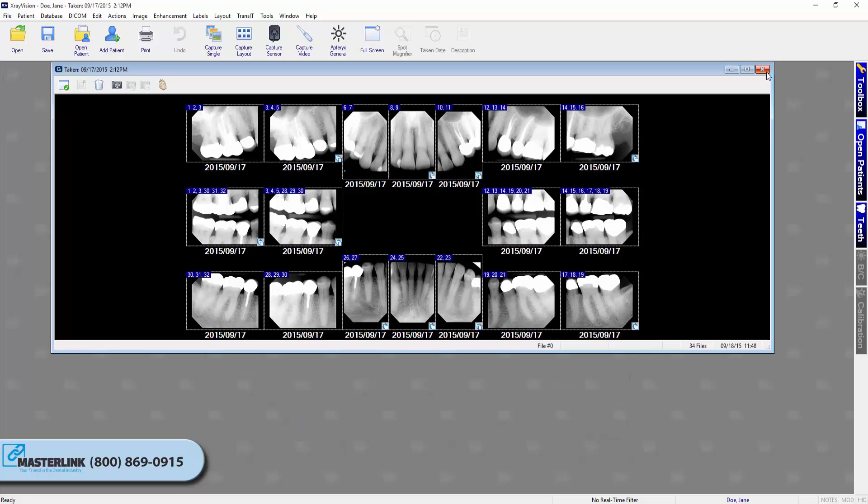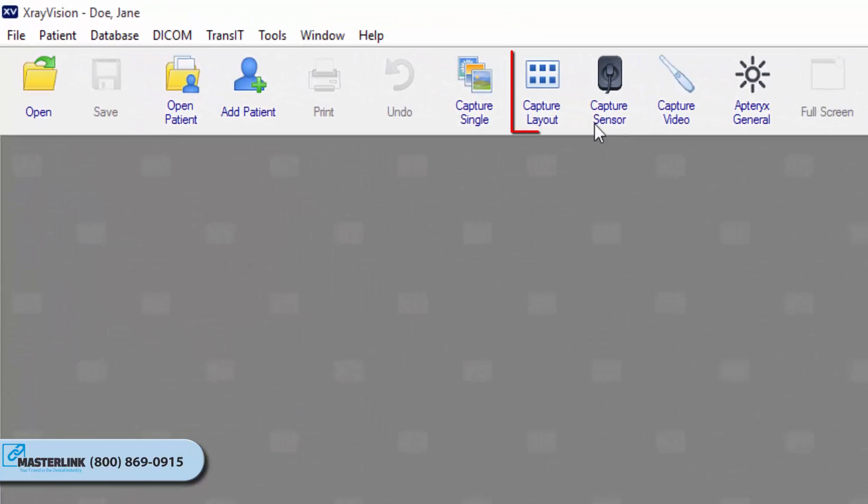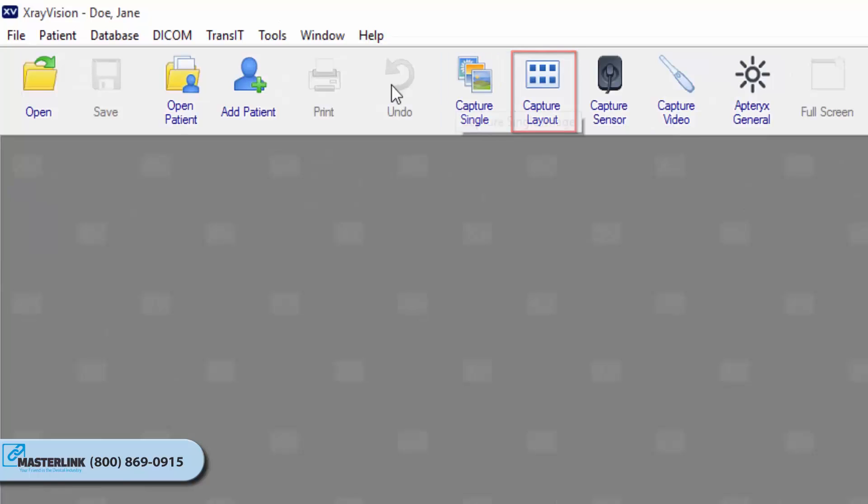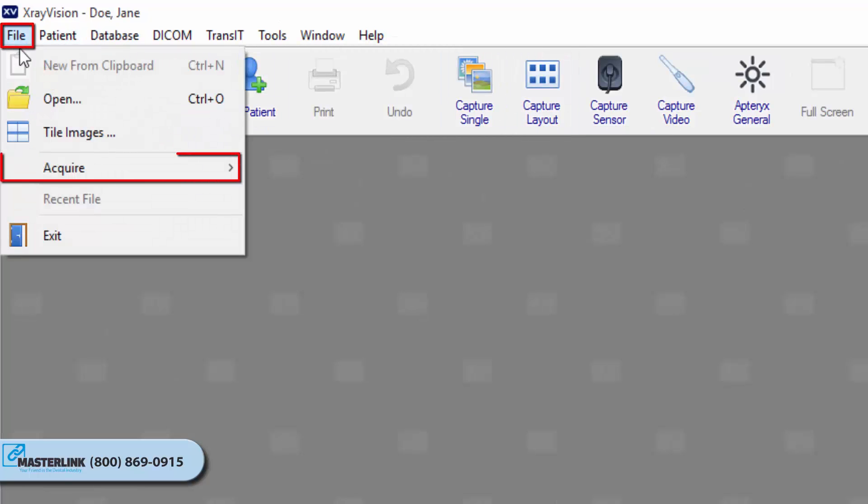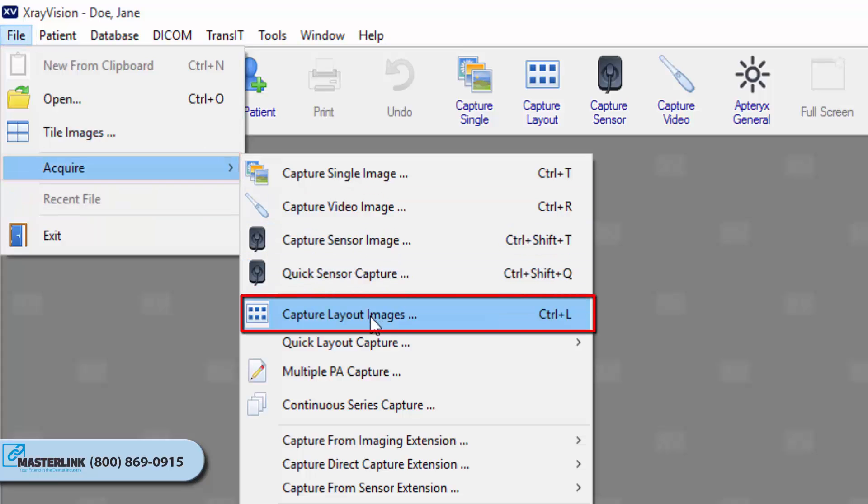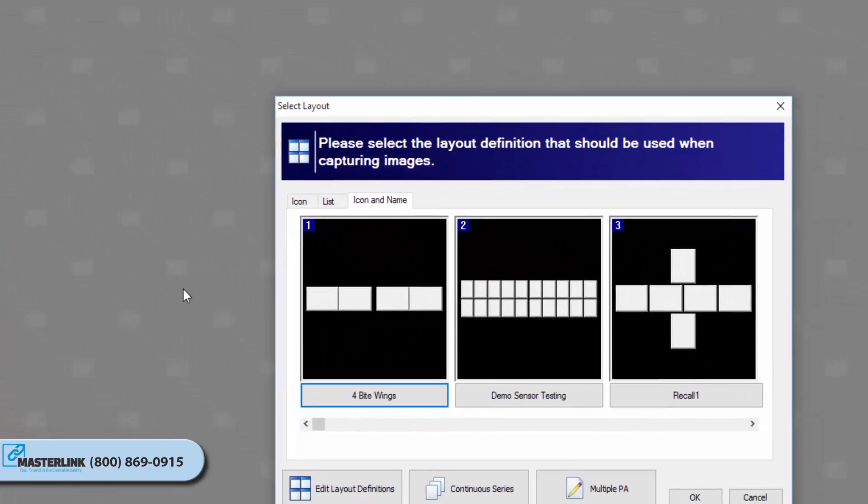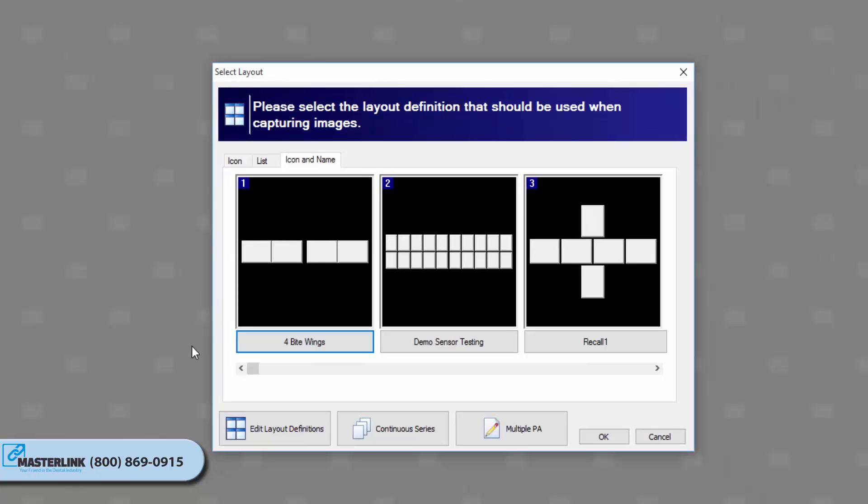To capture layout images from the current patient, click on the Capture Layout Images icon on the toolbar, or click File, Acquire, Capture Layout Images. The Select Layout screen displays, allowing users to choose the layout definition to be used for capture.